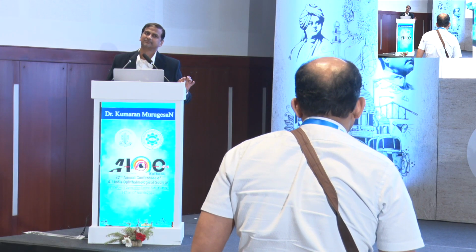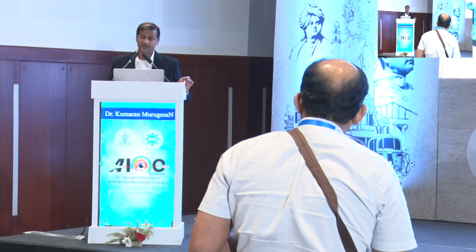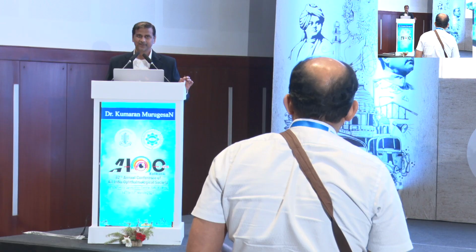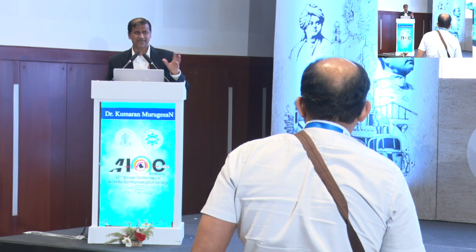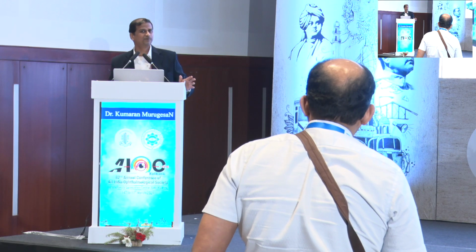You said some surface disinfectant with aldehyde-free chemicals. Can you give a name? It is not aldehyde free, it is formaldehyde free. Yeah, so there are different brands available. What I use is the Aldi one, which has a concentration of 3% glutaraldehyde or something, which I'm not very particular about.